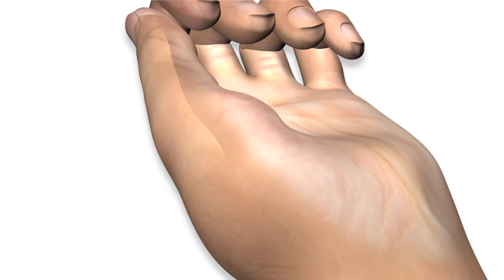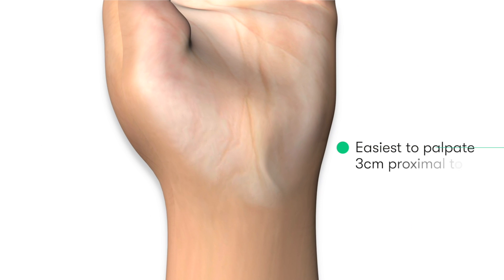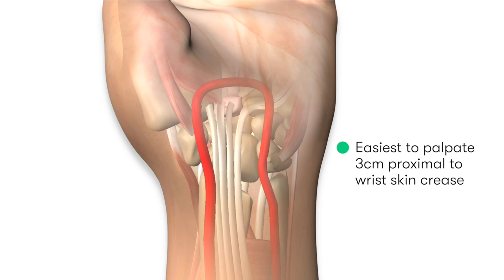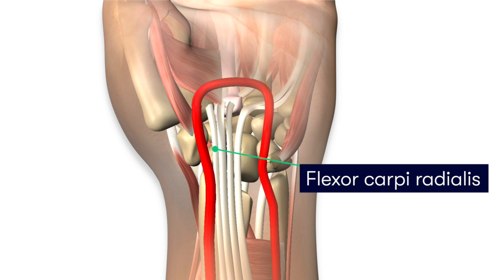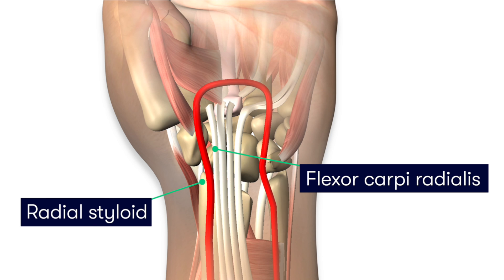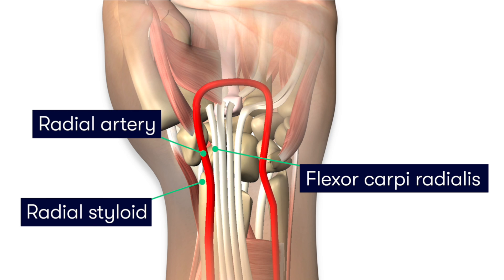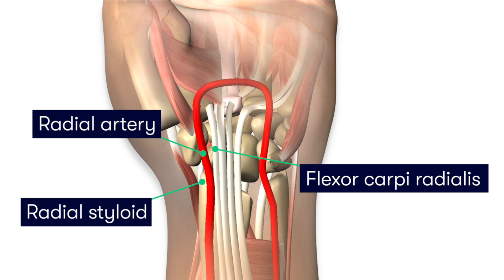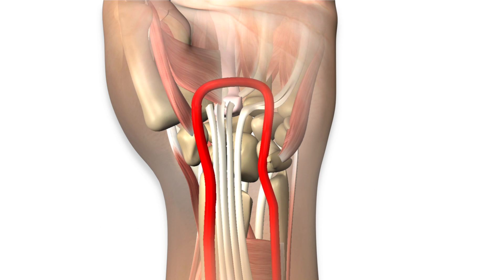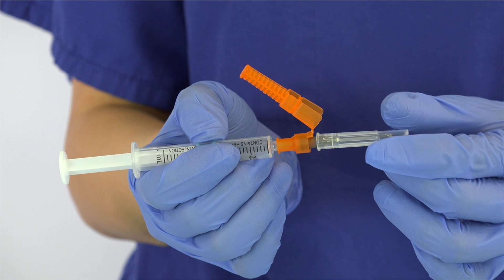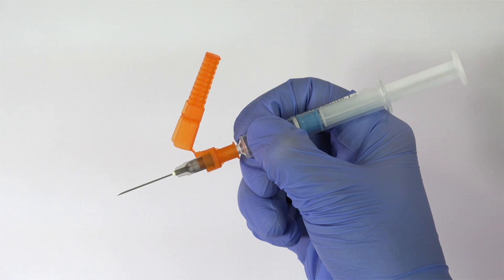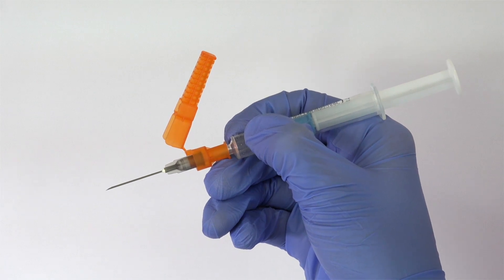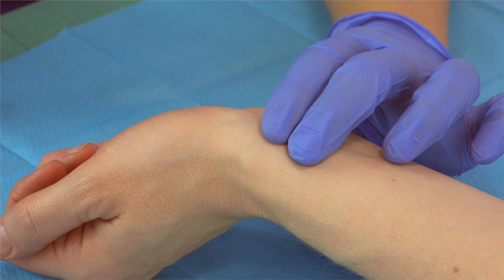In most cases, the radial artery is easiest to locate and access approximately 3cm proximal to the skin crease of the wrist on the ventral surface, lateral to the flexor carpi radialis tendon, and medial to the radial styloid process. When feeling the artery, try to visualise its course underneath the skin. Now that we are happy that we know the exact location where we want to insert the needle, we can unsheathe the needle and hold the ABG needle and syringe between our thumb, index finger and middle finger, similar to as you would hold a pen.